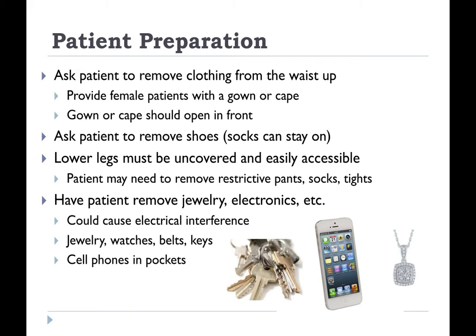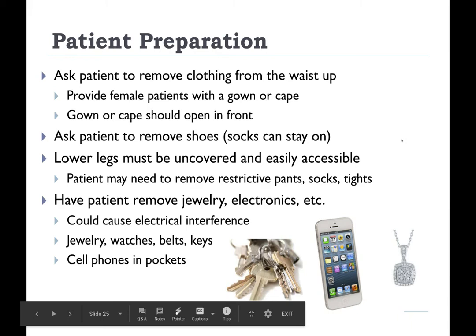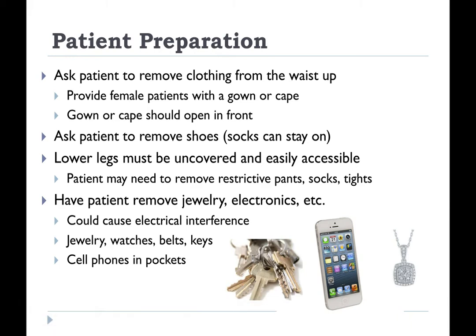You're going to ask the patient to remove their shoes, but they can leave their socks on. And the lower leg must be uncovered and easily accessible. That's why restrictive pants, socks, and tights are not easy to get around. Might have to remove those. And you're going to have them remove all jewelry and electronics. So watches, belts, keys, cell phones, and pockets. These can all cause electrical interference. I've also found that patients' glasses can do that as well. So you might have to have them take those off as well. If they don't have a purse or a bag that they can place those items in, you can put a towel down on an exam room counter and have them place everything there so that they can see it.